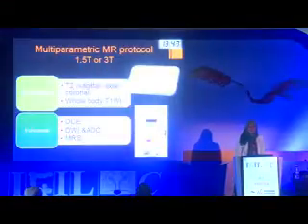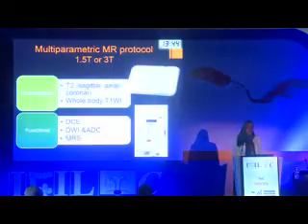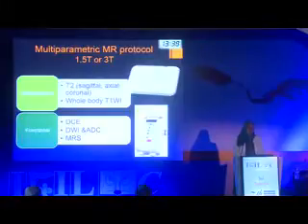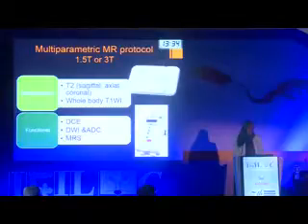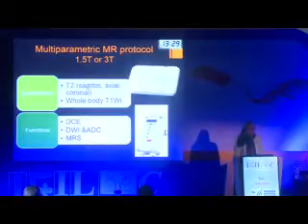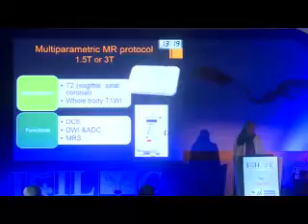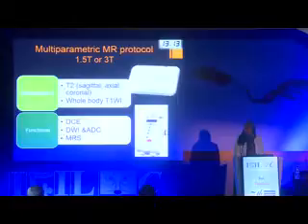How to perform MRI? MRI should be performed in a multiparametric fashion. We should perform it in a high field machine, either 1.5T or 3T. No endorectal coil is recommended, especially when we perform it on a 3T machine. We perform two major imaging criteria. First, morphological imaging, including T2 in multiplanar fashion. Also, we perform T1 weighted image to assess osseous load. Then we perform the functional imaging, including dynamic contrast enhanced study, diffusion and ADC, as well as MR spectroscopy.